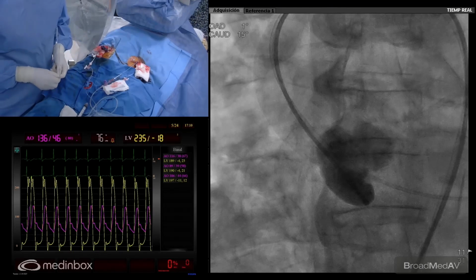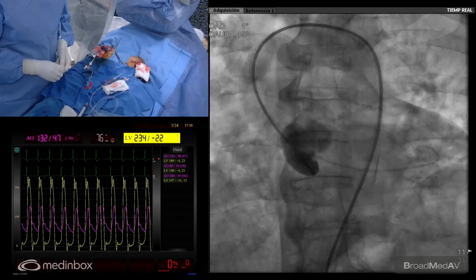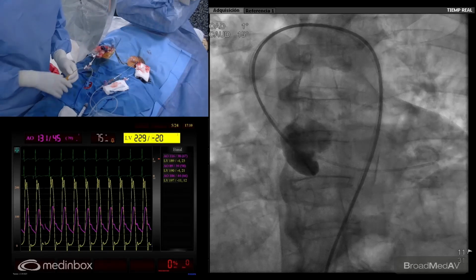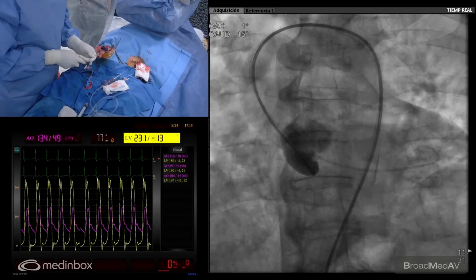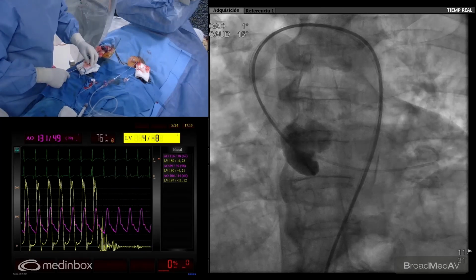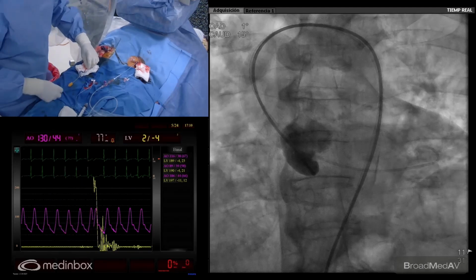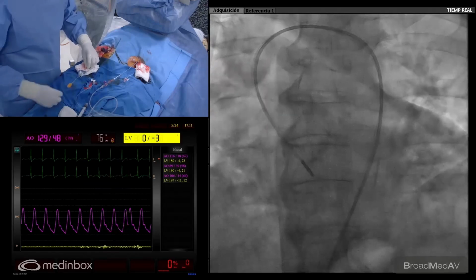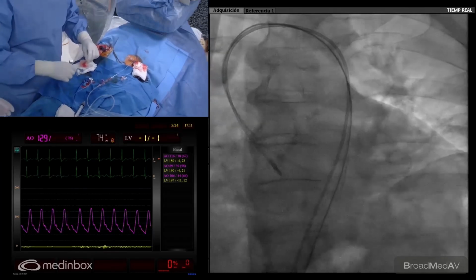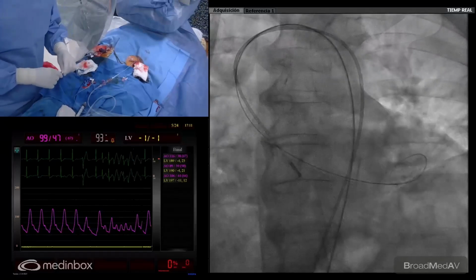If I had to perform this case with a self-expandable valve, probably I'm going to go with an extra stiff wire. But this is not the situation when we have a deflectable catheter. I think it's not necessary. I know that probably Dr. Gemal would say that he's going to use it also here. But we are still reluctant to use it in all the cases. We use it for tortuous iliac, heavily angulated aorta, 34 valve, self-expandable valve, I mean.